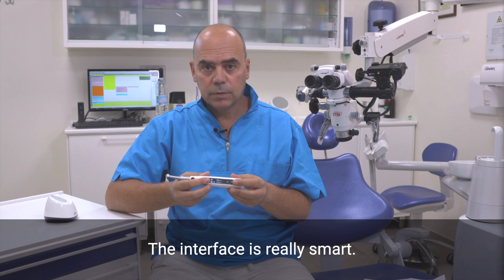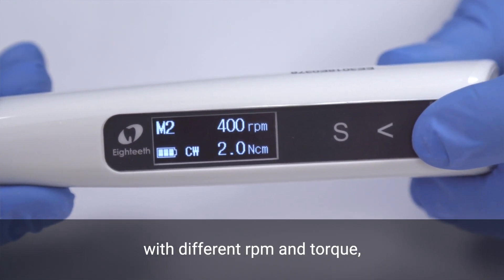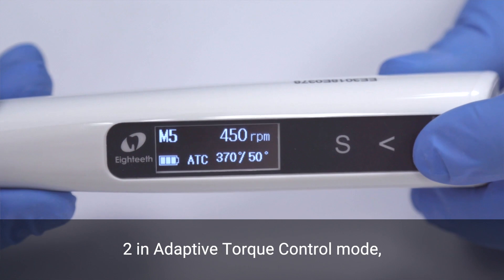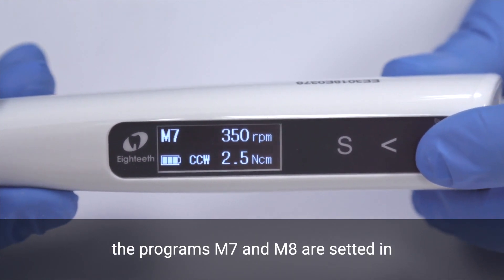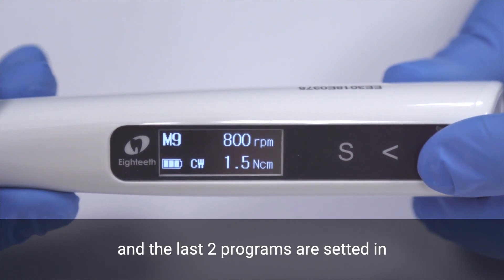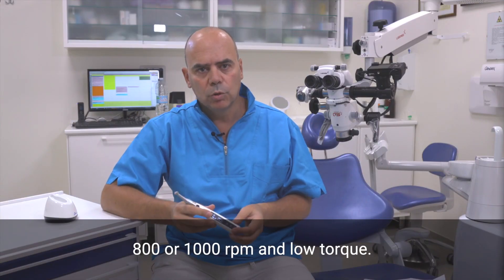The interface is really smart. Immediately after switching on, 10 memory programs are available: two with clockwise continuous rotation with different rpm and torque, two in reciprocating motion, two in adaptive torque control mode. Programs M7 and M8 are set in counterclockwise continuous rotation with different rpm and torque, and the last two programs are set in clockwise continuous rotation with high speed of 800 or 1000 rpm and low torque.